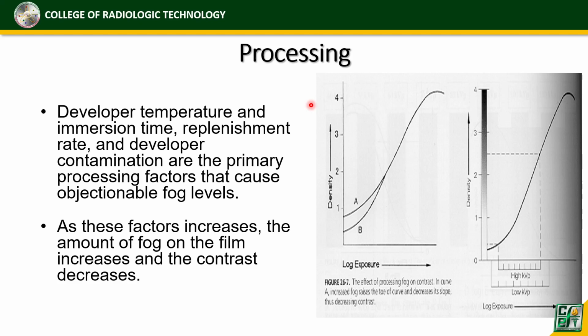Okay? So, on the other hand, kapag naman automatic processor machine, okay? So, yan ay nakadepende sa replenishment rate. Okay, and of course, the developer temperature. Okay. So, tandaan nyo pa ba kung ano yung normal range dapat ng developer temperature? Ano dapat ang temperature ng developer?